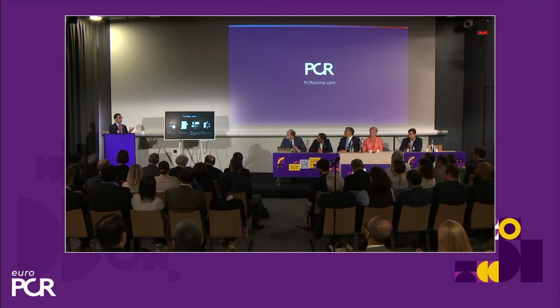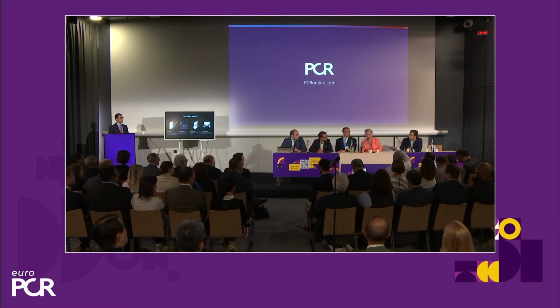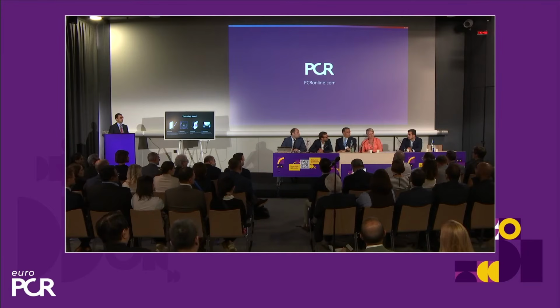The most important thing is that you take the correct projection because, of course, if you have some foreshortening, you are reducing the reliability of QFR. So take a good projection, make a good injection, and make sure that you have a frame rate of 15 at least, and that's it. And sometimes it's more accurate than FFR, so maybe FFR is not a good comparison. I will show you a case of a tortuous LAD where I think for FFR you would have had a false positive because it straightens the vessel too much.